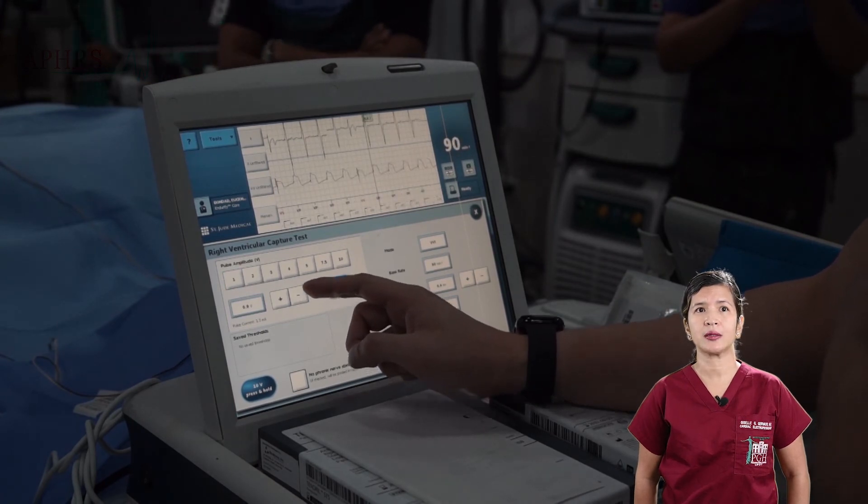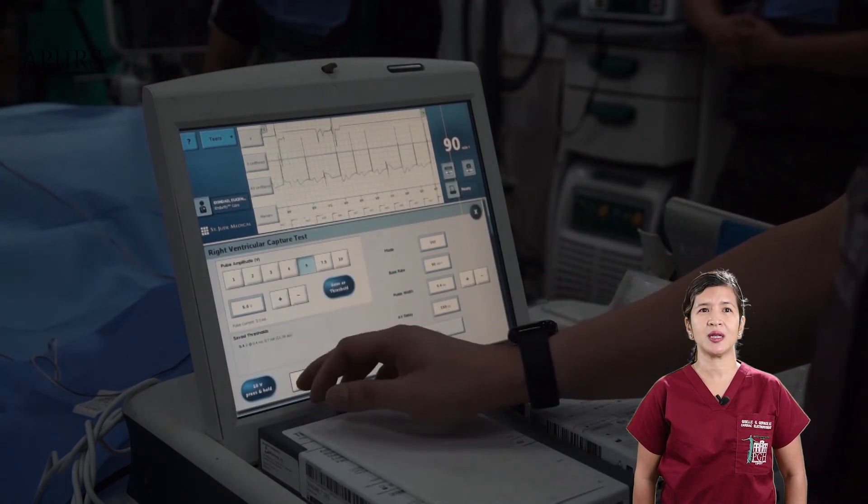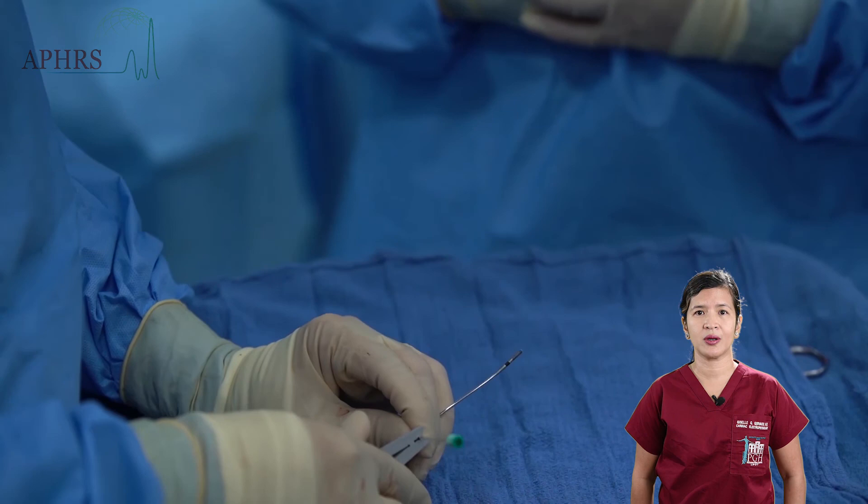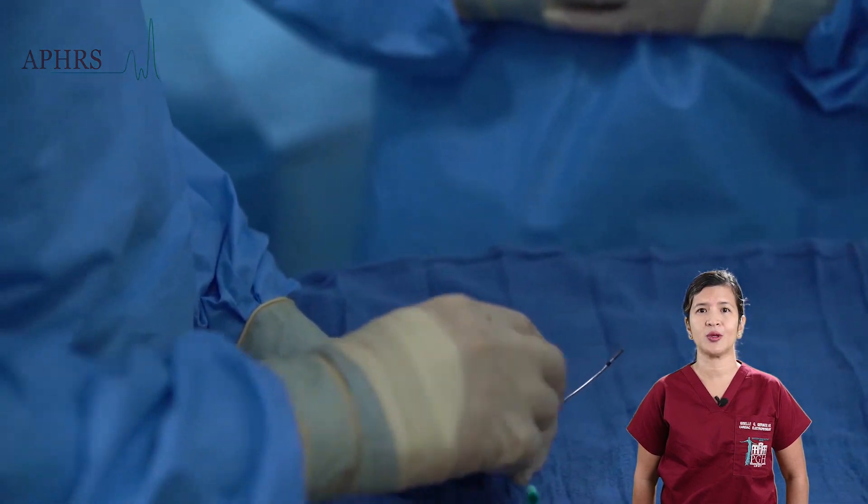At 0.7 volts, high output pacing is performed by pacing at 10 volts to ensure that there is no diaphragmatic stimulation.